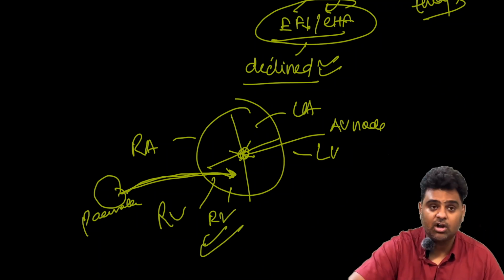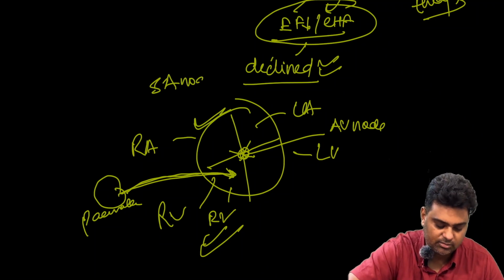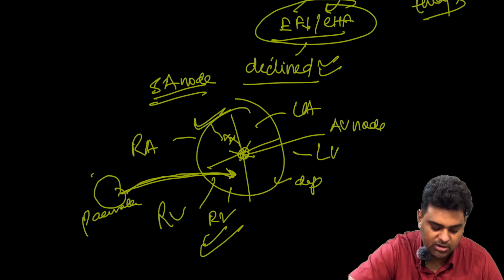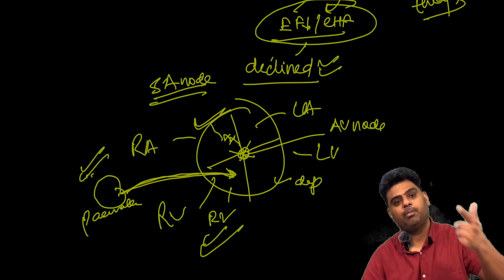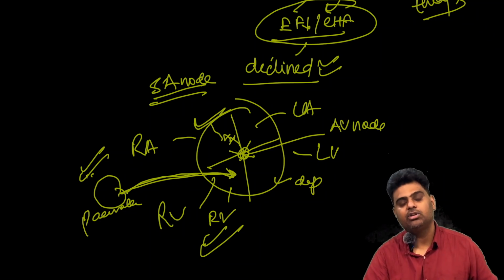So now the atrium is under the SA node, and none of the depolarizing waves of the SA node is coming to the ventricle, and the ventricle is depolarizing only with the help of the pacemaker. So ventricular rate is pacemaker dependent. This is the ablate and pace therapy, where we ablate the AV node and pace the ventricle, and ventricle contraction is dependent on the pacemaker.